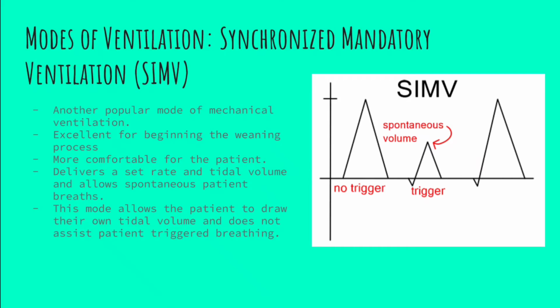So on the right, we've got the graphical representation. We see the first breath being the ventilator-delivered breath, and you've got the second one here where the patient triggered their breath, and it's a much smaller tidal volume than what was delivered by the ventilator.